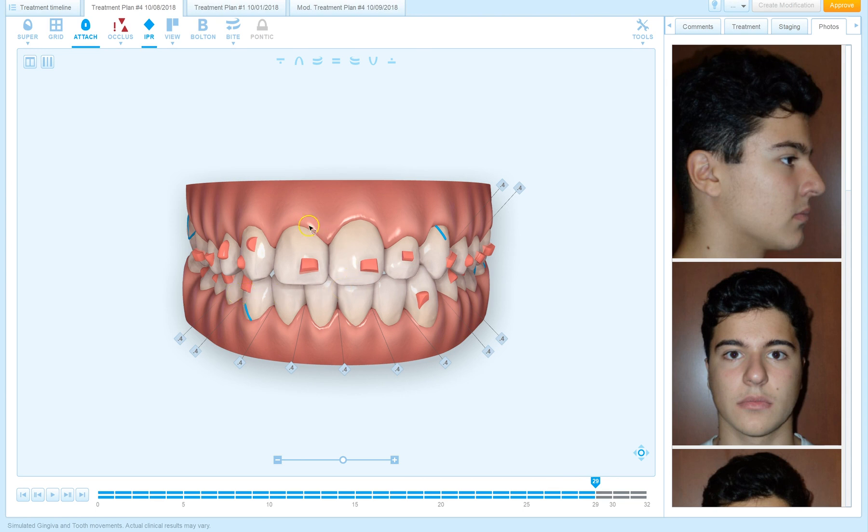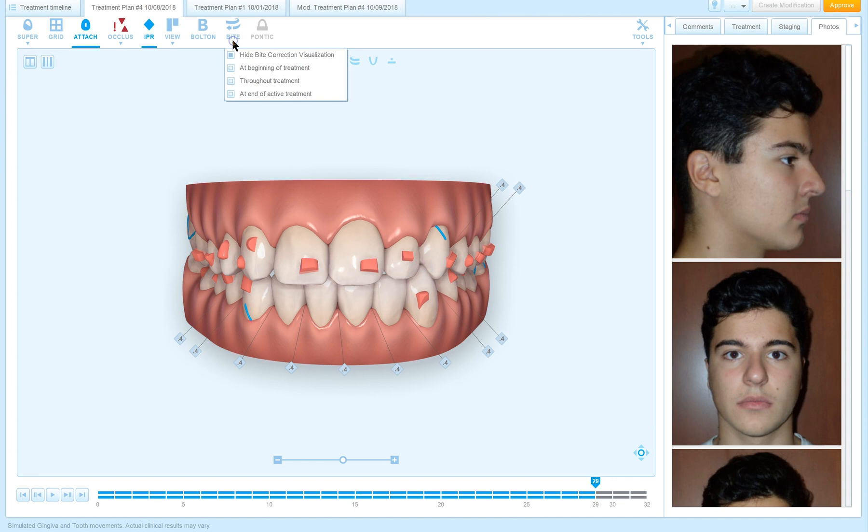So what happened? Aren't we moving the upper midline? Well, what we're doing is we're hiding the bite jump. It's as if the patient's not going to wear elastics - this is the result we're going to get. Notice I can still approve the aligners, which means changing the bite jump doesn't change your ability to approve aligners because it doesn't change the aligners.